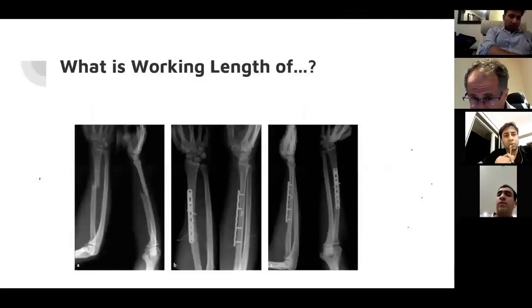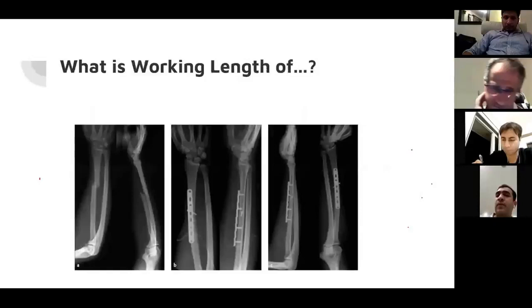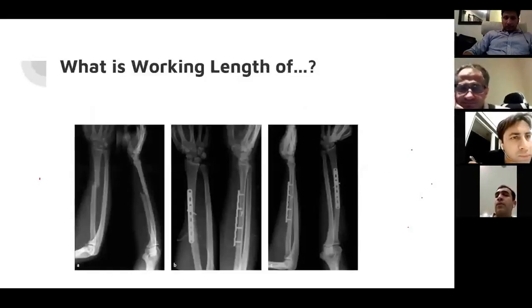Yeah, so I could see 3 X-rays in this. The first X-ray radiograph shows the fracture of the radius. Anything about that pattern? In both AP and lateral view, this seems to be a short oblique. Okay, good. Short oblique. Brilliant.